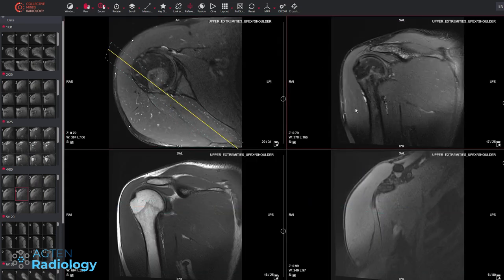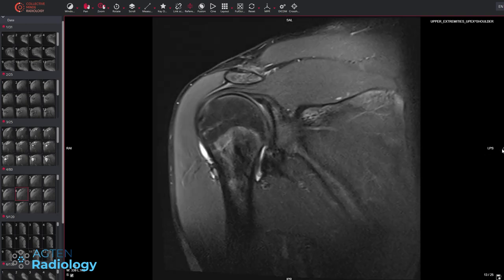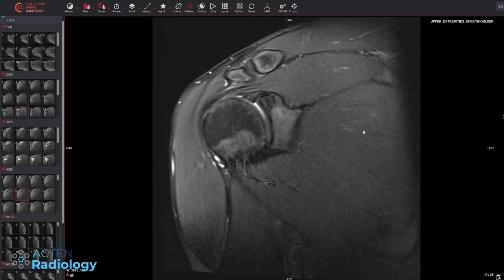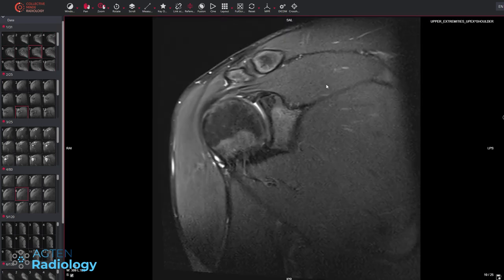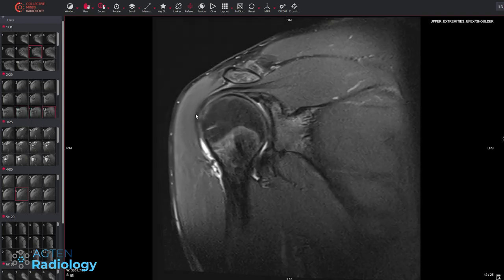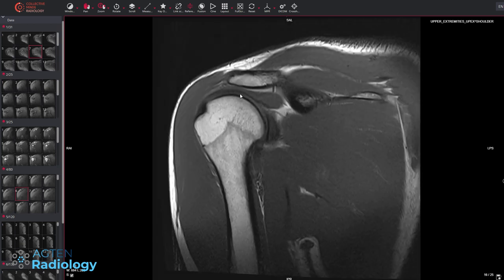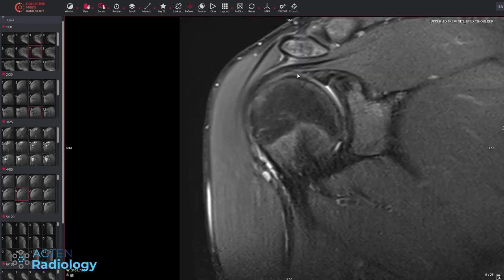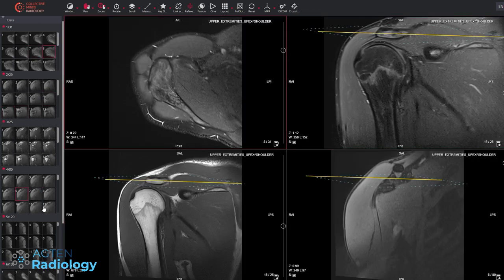This is a shoulder case — a young patient with shoulder pain. I don't think there was a recent trauma but I don't have the clinical information. Going through systematically: starting at the top, the AC joint looks good. On the coronals there is no bursitis. The acromion shows no significant degeneration. Moving to the rotator cuff — the cuff looks good. No tendinosis, no calcifications, no partial tears, no full thickness tears.